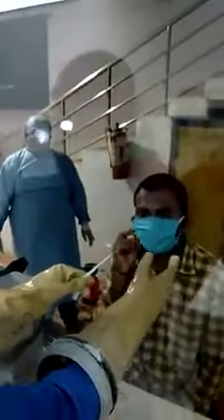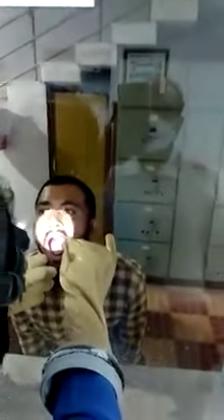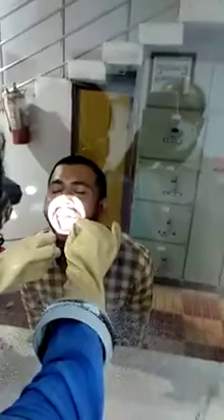The doctor is inserting his hands through the glass plate and has taken the swab, removing it — taking it out. That is the swab with which the sample is taken from the throat. This is the moment when the patient is prone to cough, and that's when the glass pane helps in protecting the doctor.